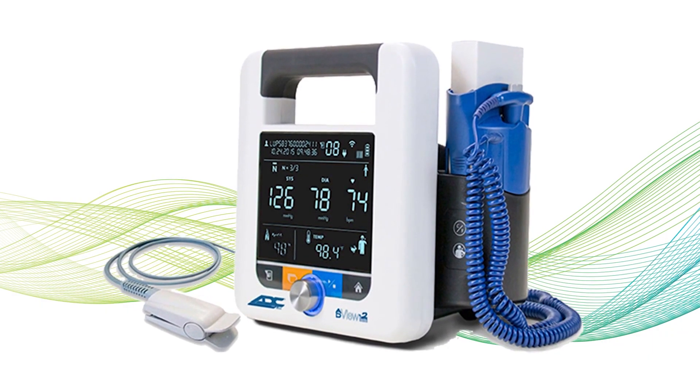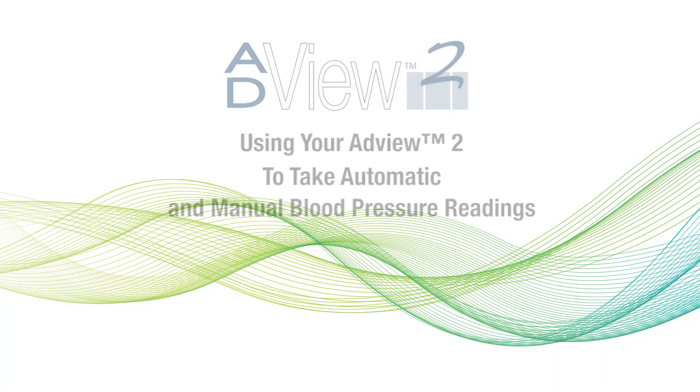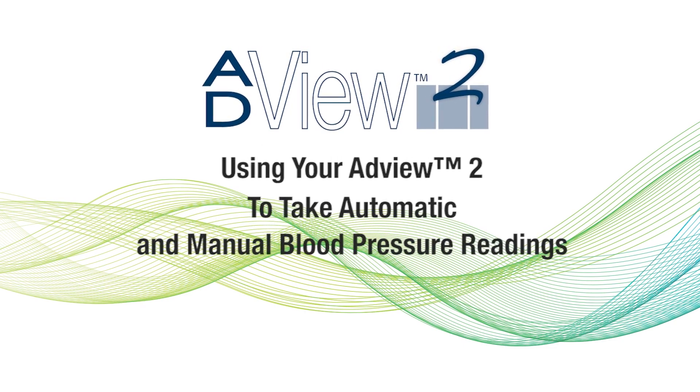Welcome to ADC's series of instructional videos for the ADVUE-2 Modular Diagnostic Station. In this video, we'll show you how to take a single automated blood pressure reading, as well as a manual blood pressure reading using your ADVUE-2.